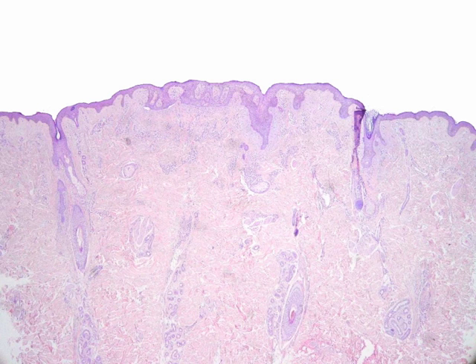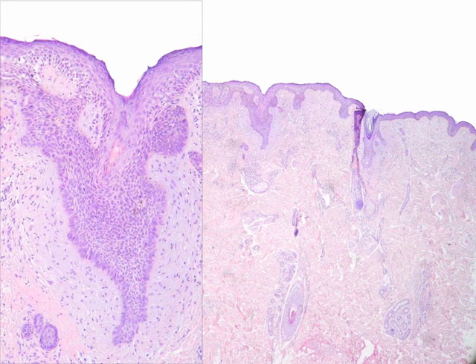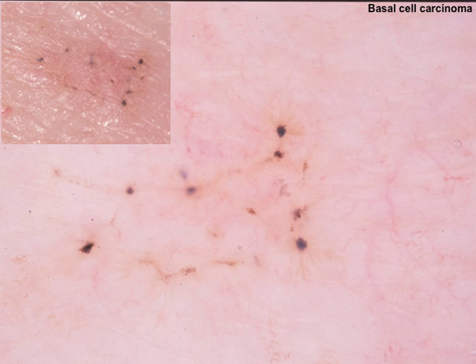Histopathologically, you see the center of the lesion, and at higher power you see the basal cell carcinoma spreading from the center towards the periphery. Looking from the top, it explains very nicely the aspect of the spoke-wheel areas. Sometimes this is very subtle — a very superficial and early case of pigmented BCC where you have the dark centers resembling globules and, if you look very precisely, light brown radial projections around them.